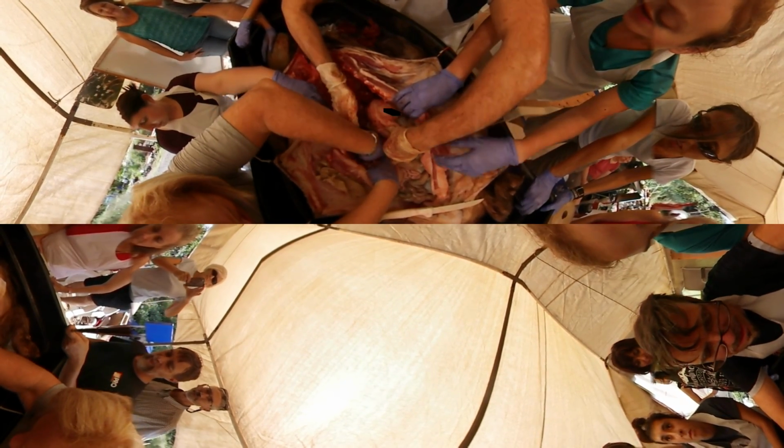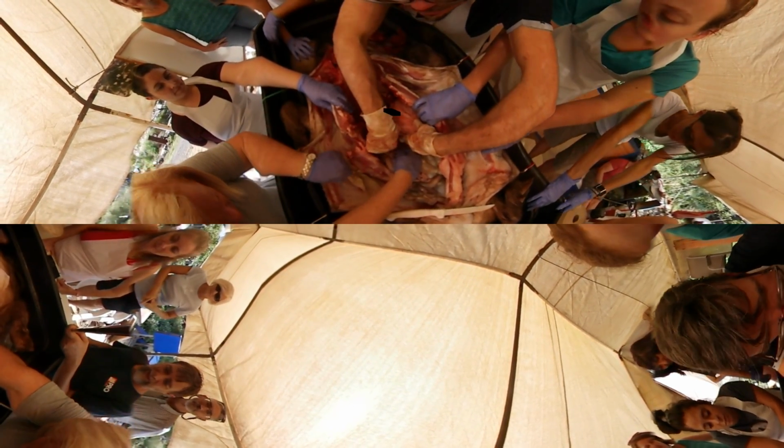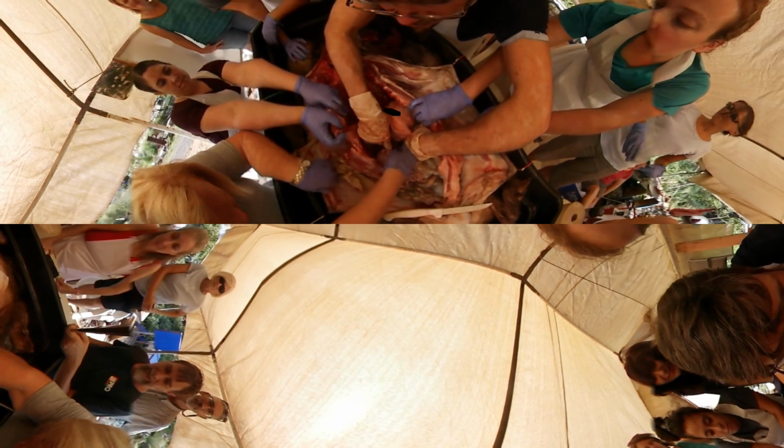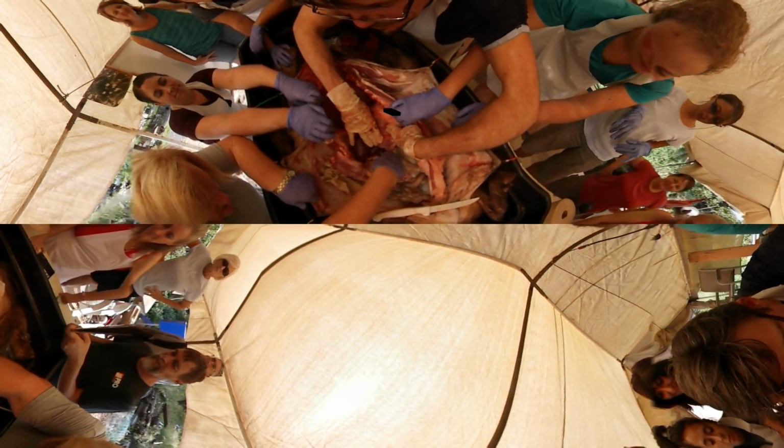Why does the stomach have purply bluish things? Those are vessels, veins. Lots of veins. Is that all liver? That's a lot of liver. Big liver, big stomach. It's attached to the liver, so that must be a vessel. It might be the pancreatic duct, or gall duct, bile duct, because that would go down. I have not seen the gallbladder yet. Normally it's tucked in. I don't want to break this in case you want to teach from it. Well, we don't want bowel contents. No, this is a vessel.